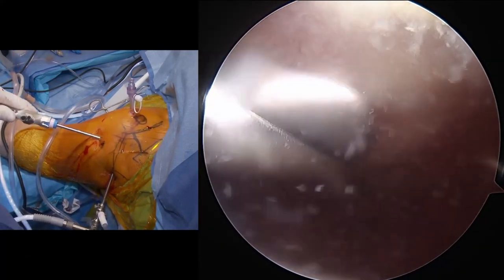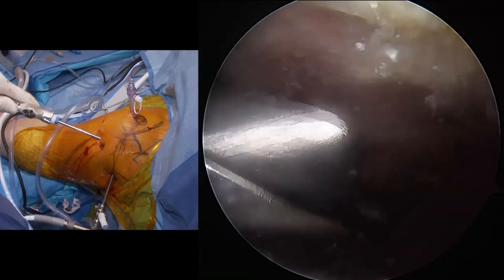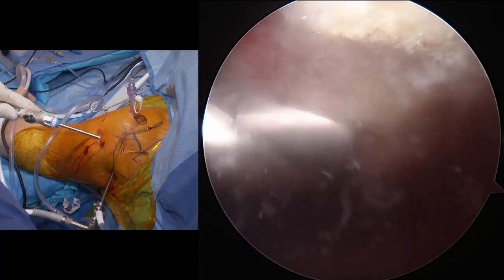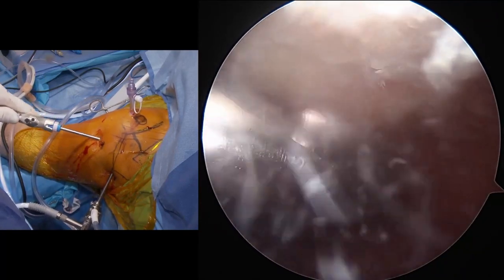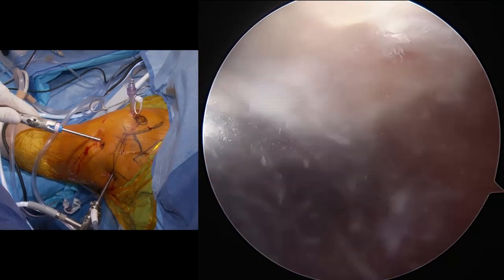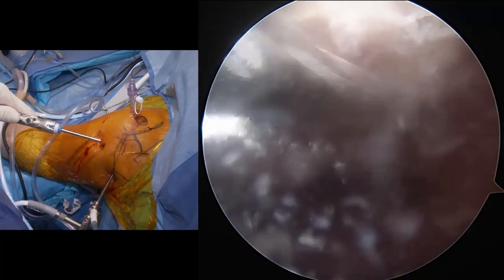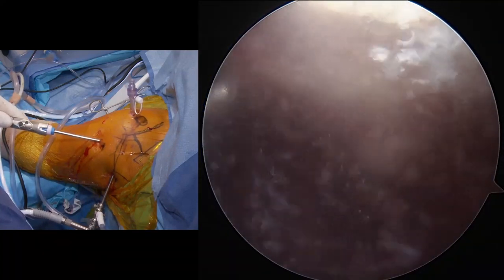So since that seems to be the more important part of the acromion to manage, to avoid further rotator cuff problems, I like to start from this position, looking from behind and working from lateral to medial, to make sure that I lift up that lateral edge and change the critical angle of the acromion so it's in a range that is not associated with an increased risk of rotator cuff tears. And then we'll switch and come from the lateral side view and use the posterior slope of the acromion to flatten out the acromion once we've already managed the lateral component.